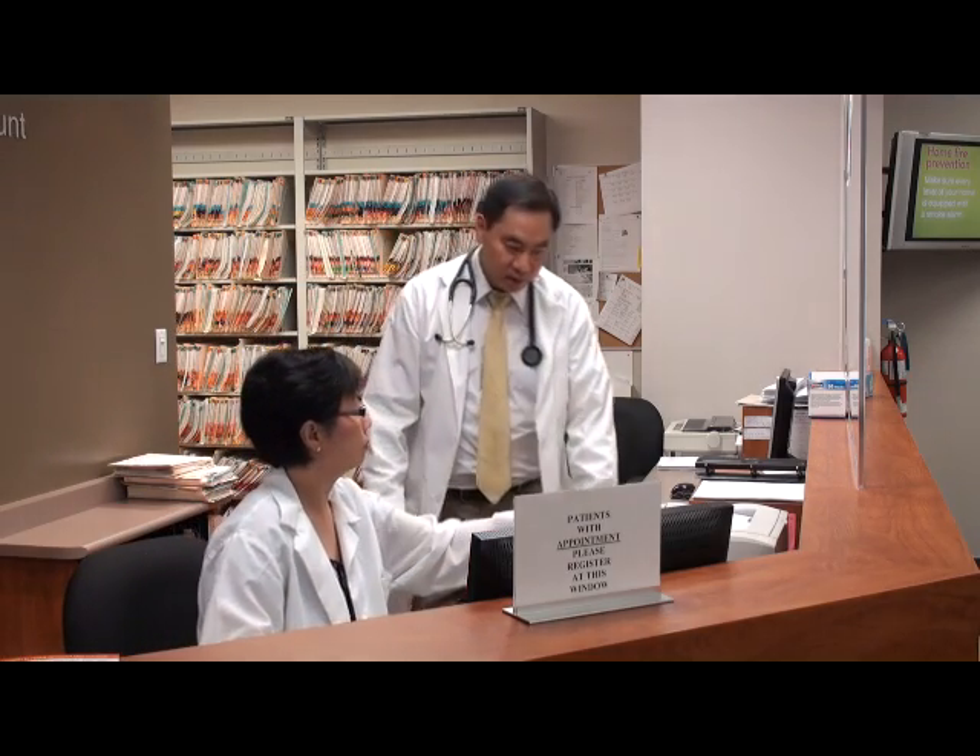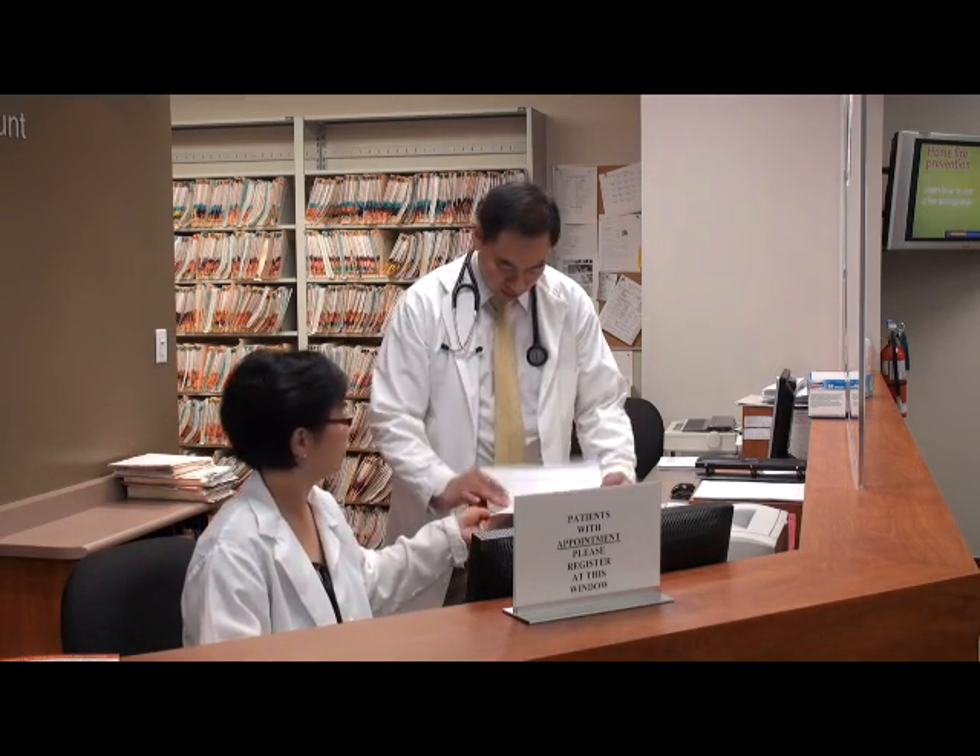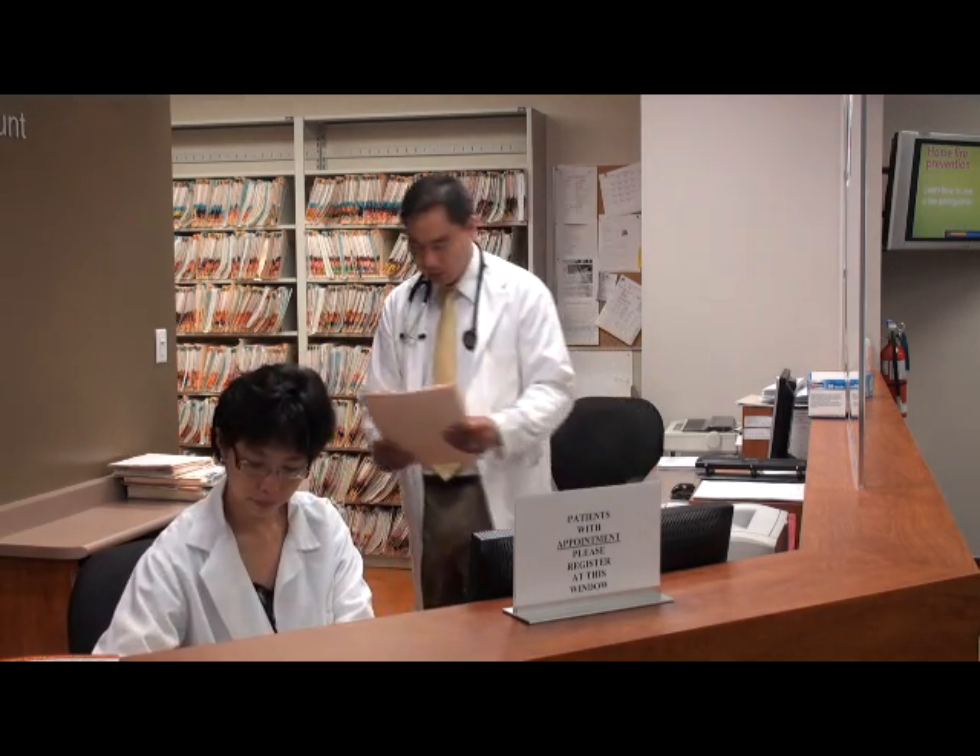The HeartCheck ECG monitor is a simple yet effective method in monitoring and discovering heart conditions.